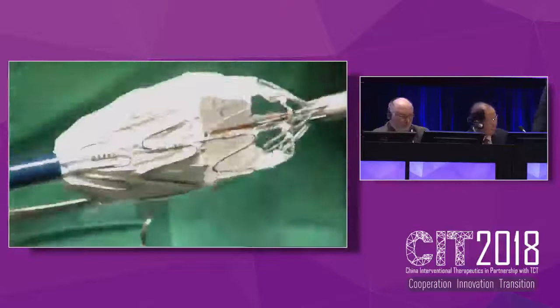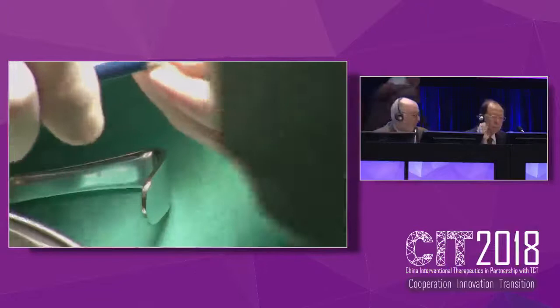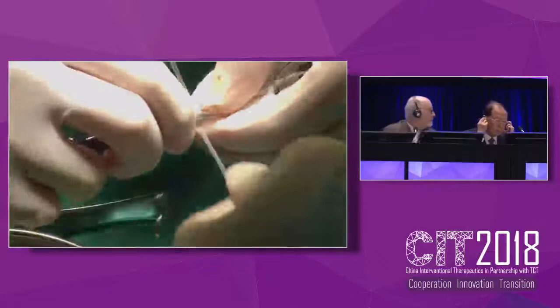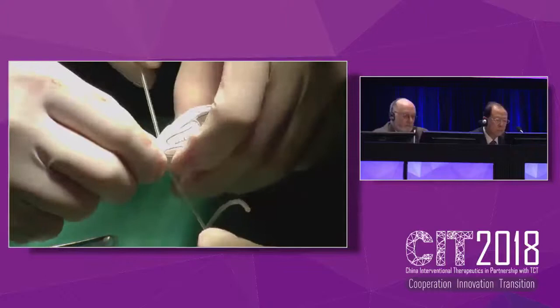So now we finish the fenestration. Now we already made the fenestration and we are reassembling the device. We are reassembling the device carefully.